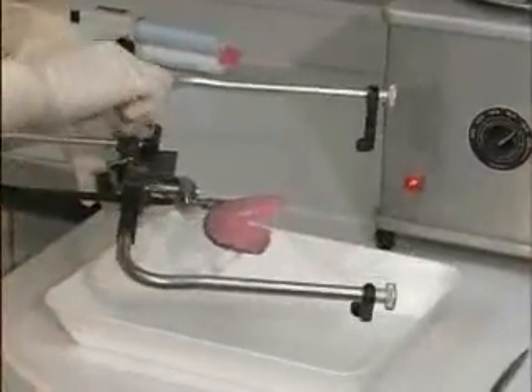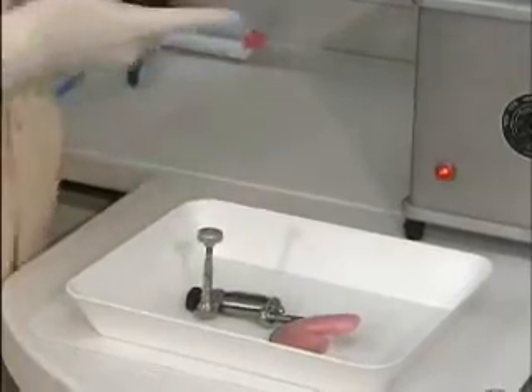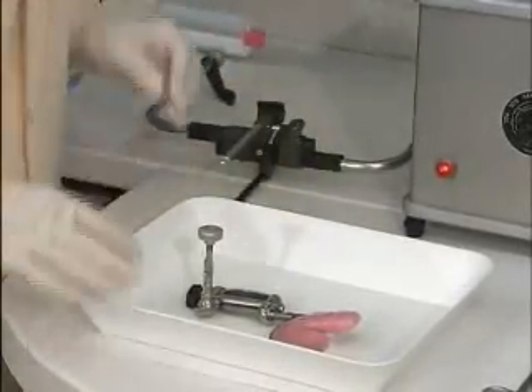Detach the joint piece and take it to the articulator to place on the transfer jig. If you don't use a transfer jig, take the entire face bow with the joint piece attached to the articulator.